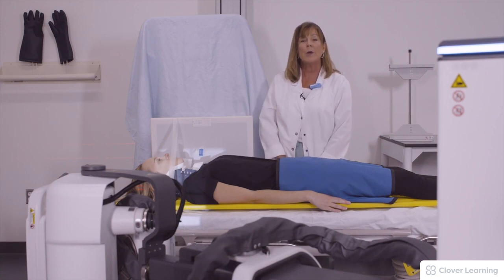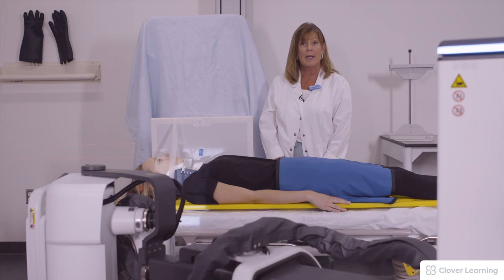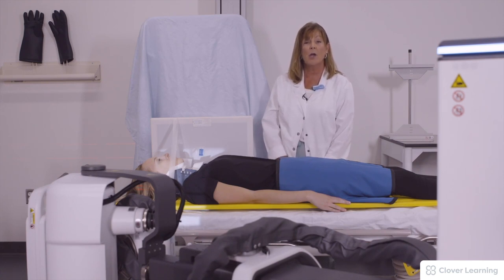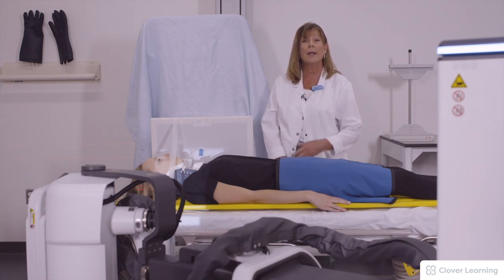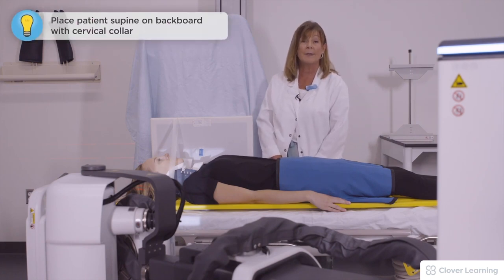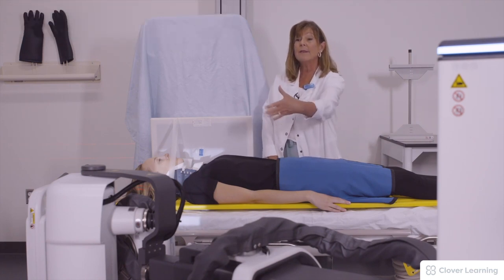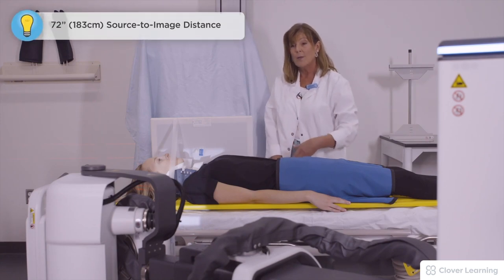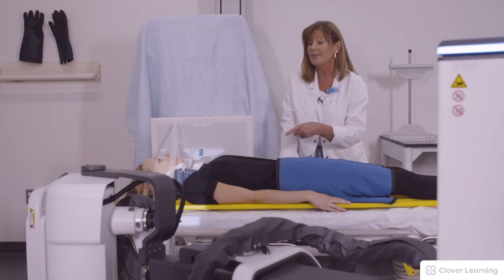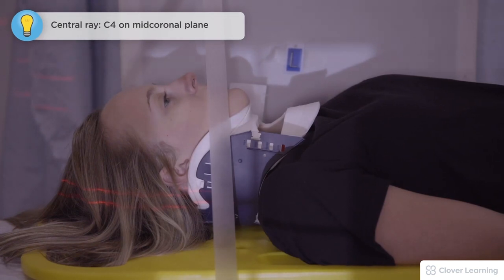In this scenario our patient has been brought in by EMS. We're going to demonstrate a portable cervical spine — she's on a backboard and she has a cervical collar on, and those items need to remain there until the radiographs are obtained. We have her at 72-inch distance, the portable machine has been brought in, and we are centered at C4 in the mid-coronal plane.